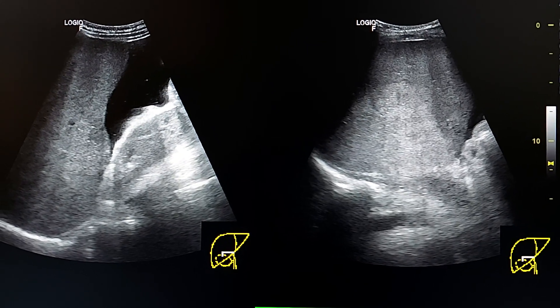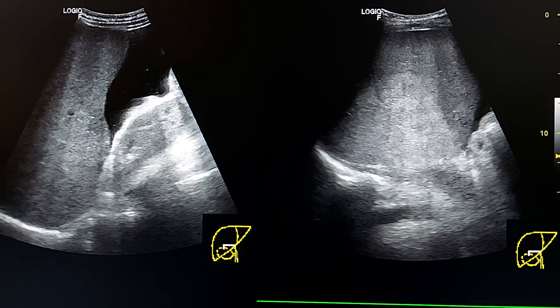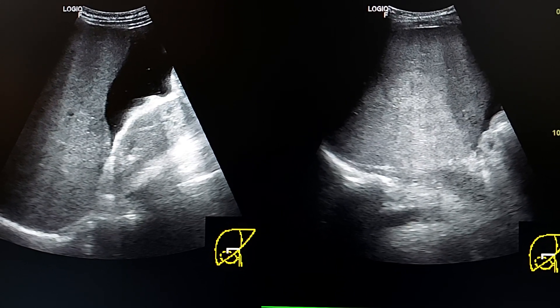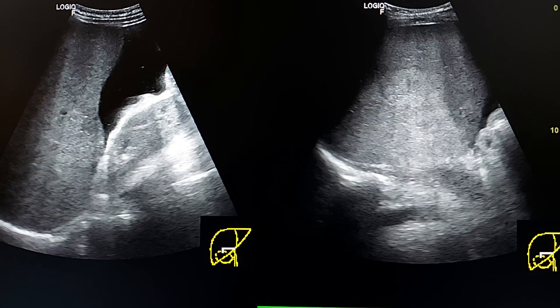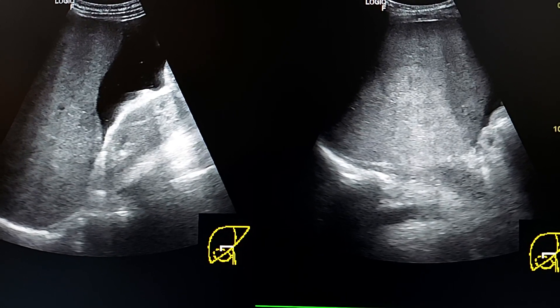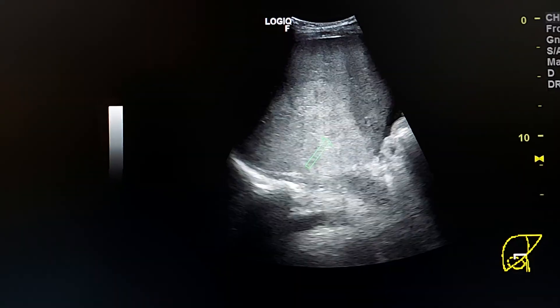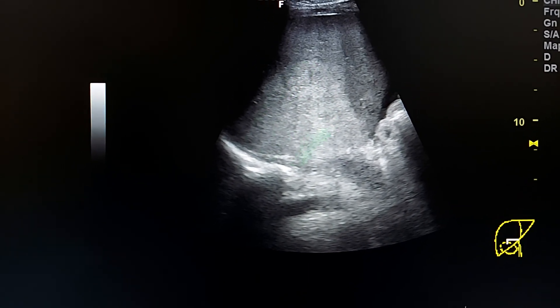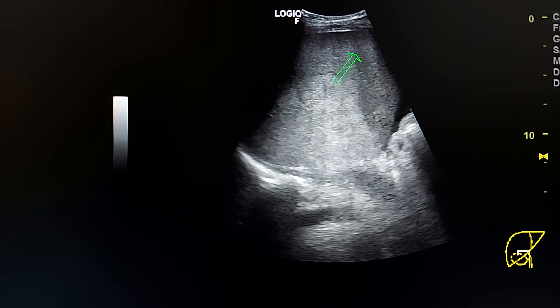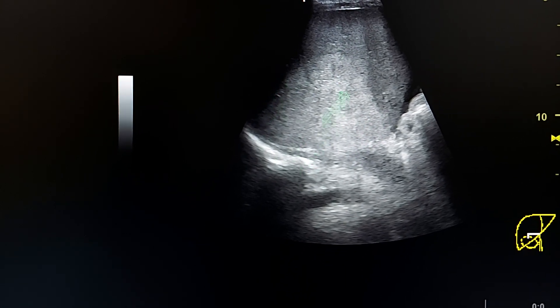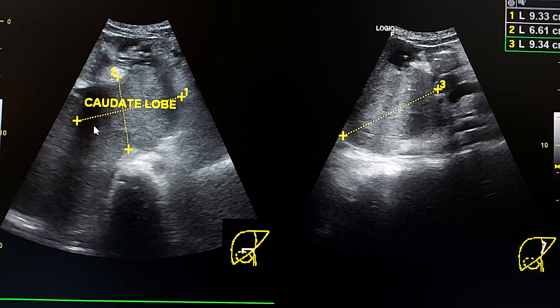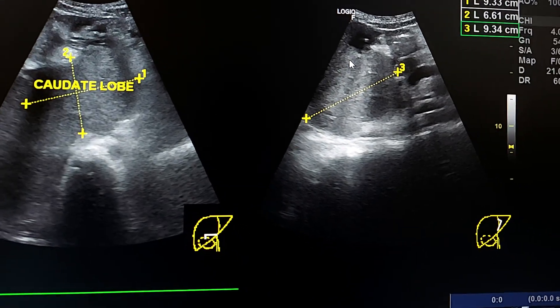29-year-old male with ascites and abdominal pain, in the late phase of Budd-Chiari syndrome. Here we see a heterogeneous texture of the liver and extensive ascites in the Morrison's pouch. Here we see a different echogenicity in the parenchyma peripherally, and this is the central liver.